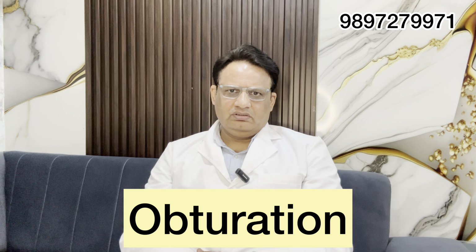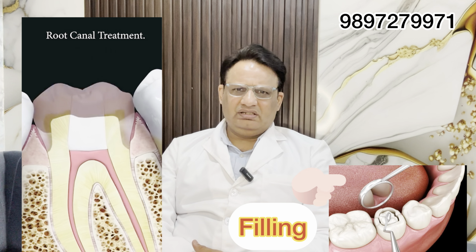Then we'll go for the last step of the RCT, which is known as obturation. Obturation is the step in which we put the gutta percha, which is commonly known as GP. Gutta percha is a biocompatible material which doesn't harm the patient or the tooth. So it's widely used in the obturation step after the RCT. We'll seal the gutta percha in the root canals, and later on we'll give the GIC filling or any other material. We'll fill the tooth, and after the filling, then comes the last step.